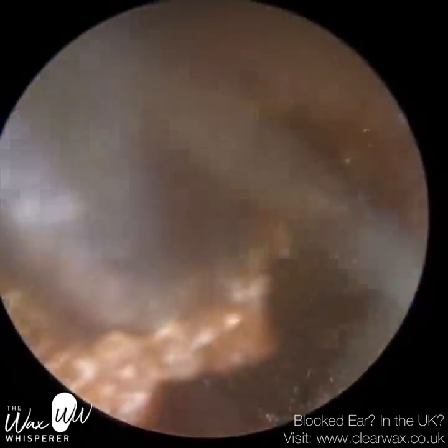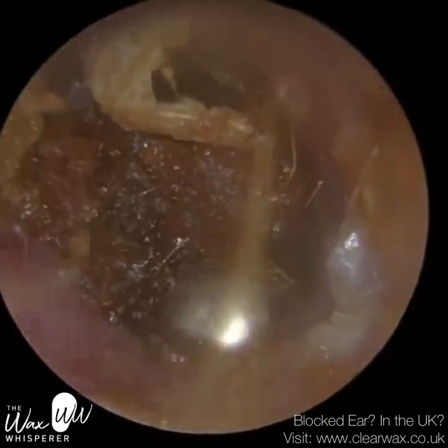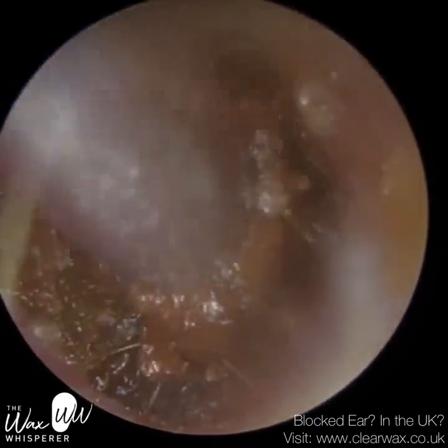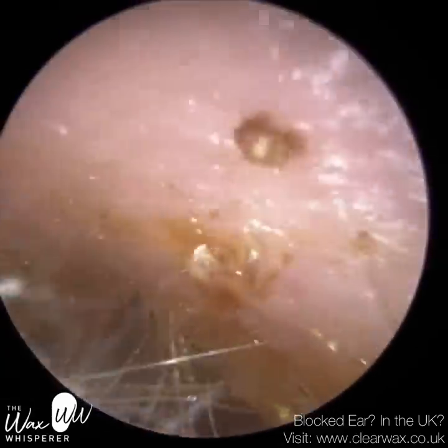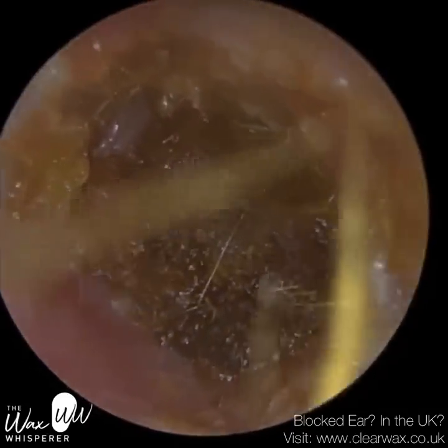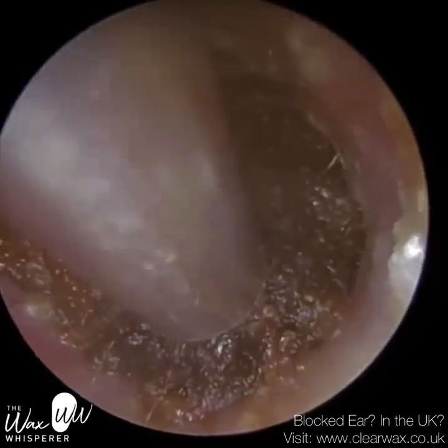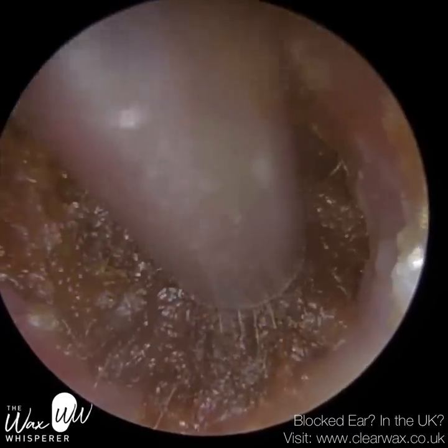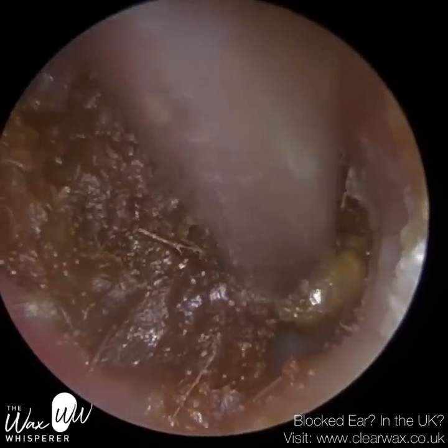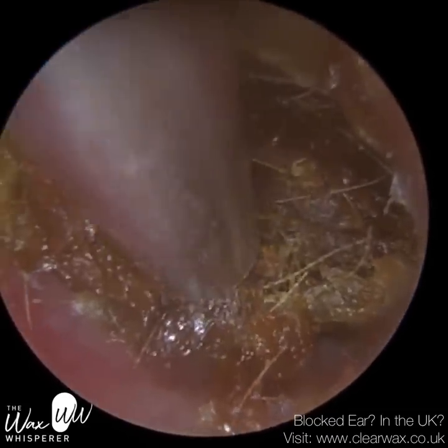You can see that little piece of granulation tissue. I was trying to avoid suctioning that, as sometimes granulation tissue gets attracted by the suction. At the end, that granulation tissue pops, for want of a better word, and it does bleed a little bit, but the bleeding stems — that's just its own blood vessels being ruptured. This is the more medial impaction, right up against the eardrum. As I'm lifting it, you may see the eardrum at the bottom around four or five o'clock — it's got a slightly blue tinge. I'm just trying to separate it off the posterior canal wall.